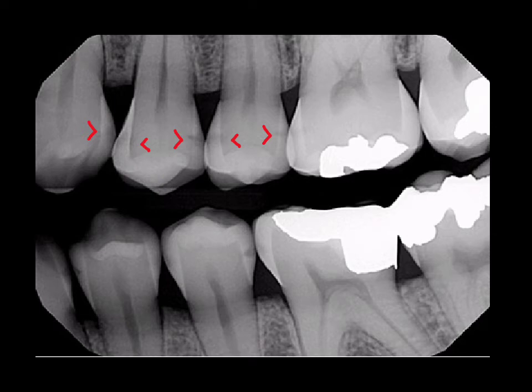We take a more anterior bite wing, which this is — we know because we've caught the canines on this. We then take another bite wing further back where the first molar is in the center of the film. The cone head is opened up a little more so we can try to get those interproximal areas on the mesial and distal of the first molar without horizontal overlap.